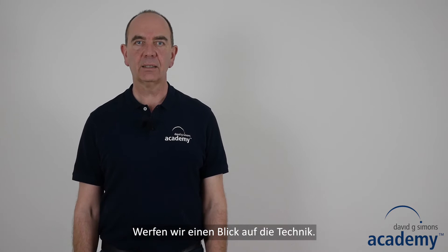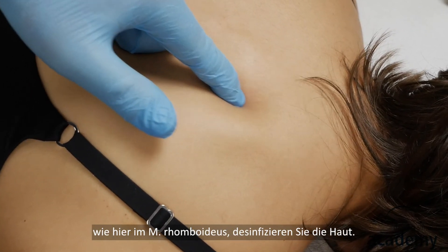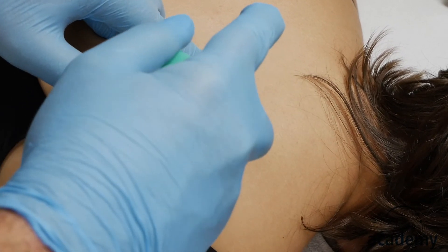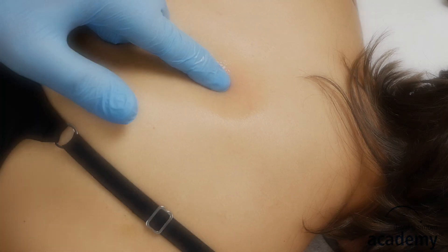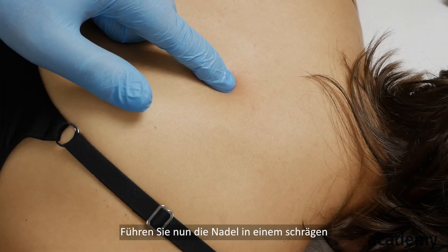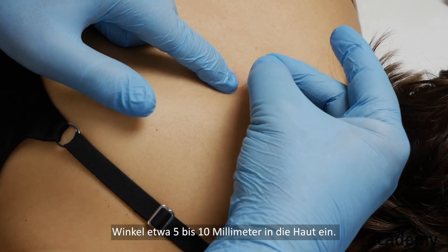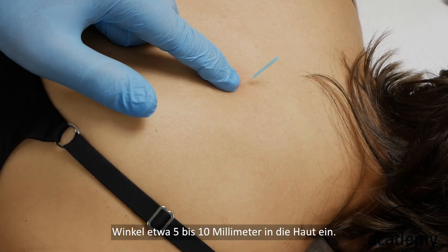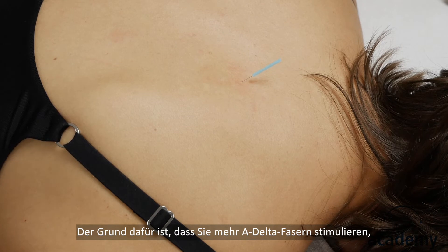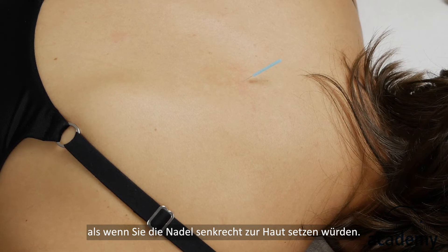Let's have a look at the technique. Once you have palpated the taut band, here in the rhomboid muscle, disinfect the skin. Now insert the needle into the skin about 5–10 mm at an oblique angle. The reason for that is that you stimulate more A-delta nerve fibers than if you would insert the needle perpendicular to the skin.